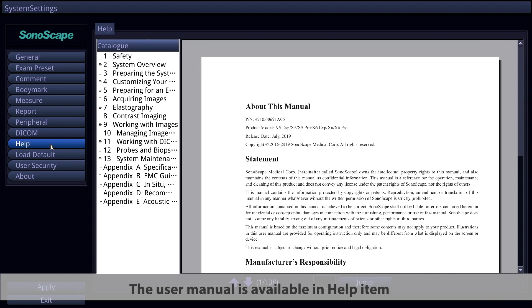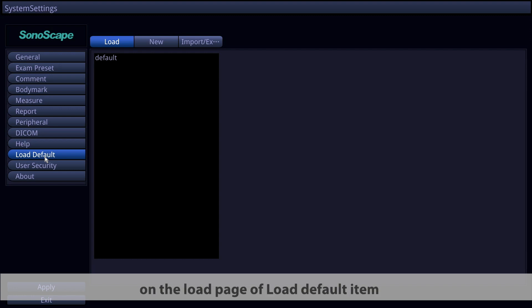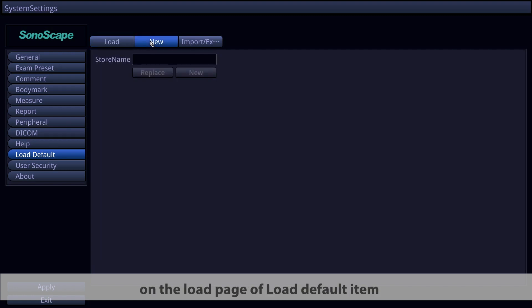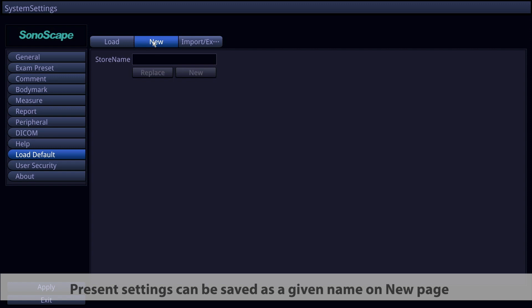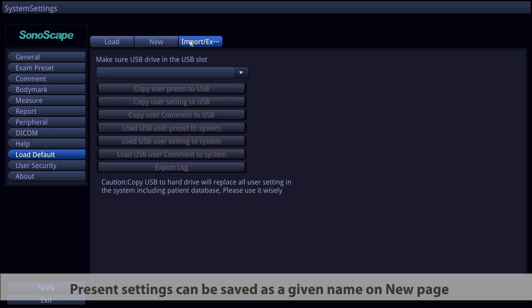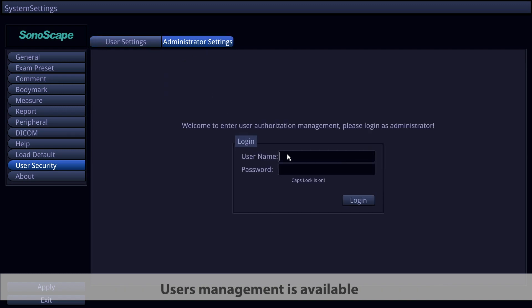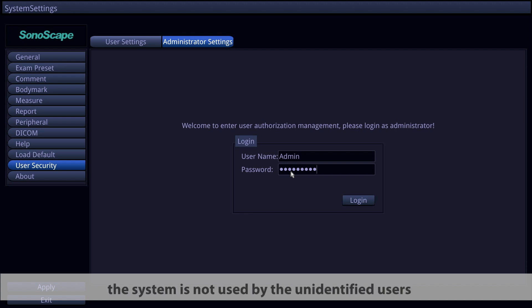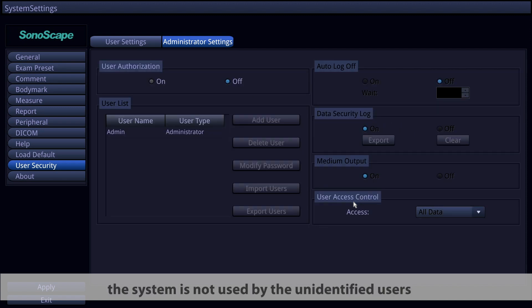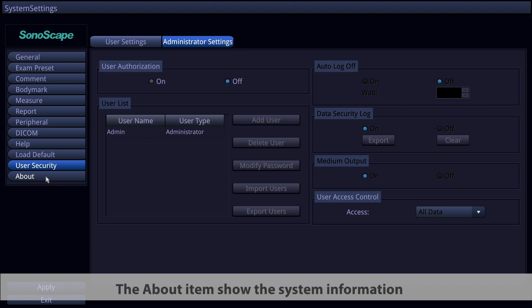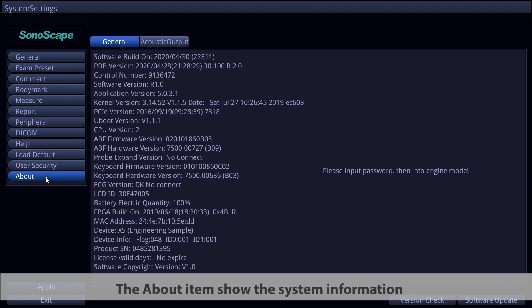The user manual is available in the Help item. You can load default settings on the Load page of the Load Default item. Preset settings can be saved with a given name on the New page. Importing and exporting settings are also available. User Management is in the User Security item to ensure the system is not used by unidentified users. The About item shows system information, which is important for troubleshooting.